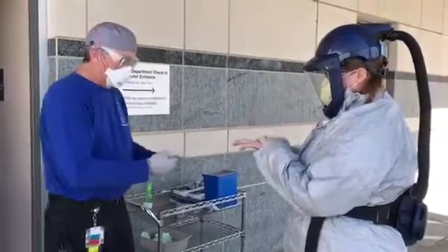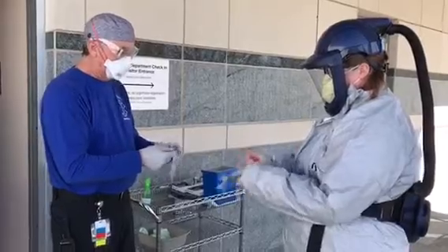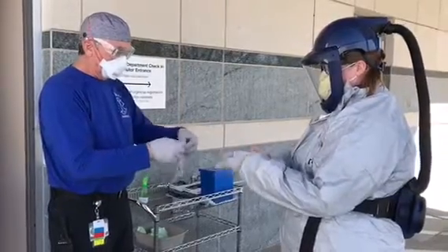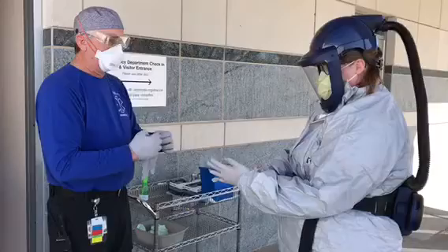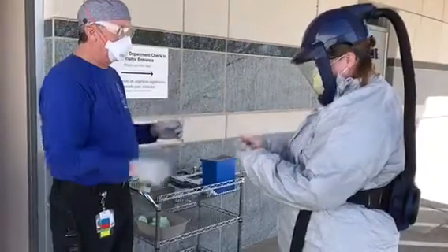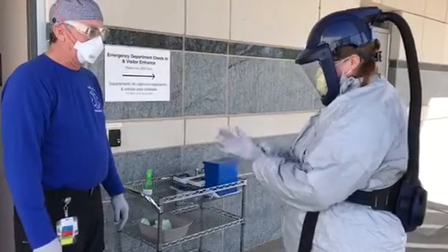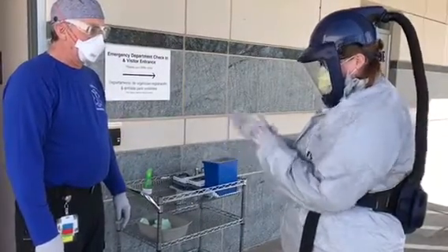This is the process that we will use if we are going to be doing multiple drive-up swabs, one after another. Now, once she has her gloves on, she is ready to do the drive-up process for the next patient.